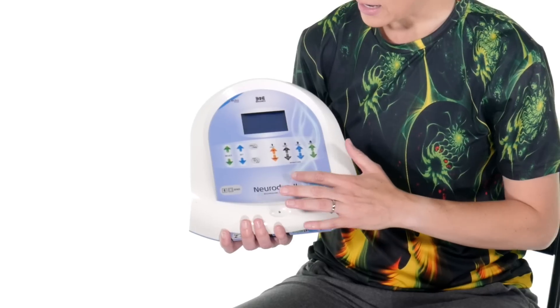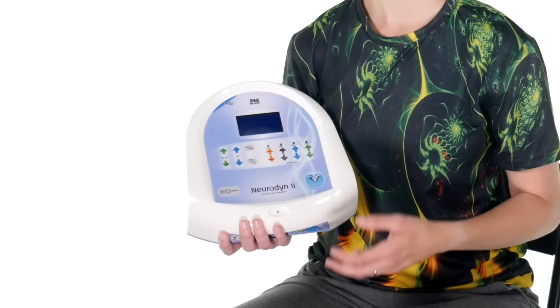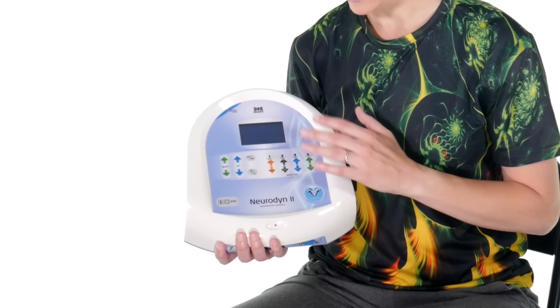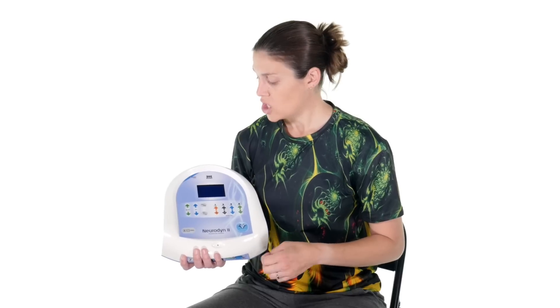It also has four different channels that you can use independently, which is really cool because this is a professional unit. When you're in the clinic, more than one person might want to use it, so having independently operated channels is a great component.